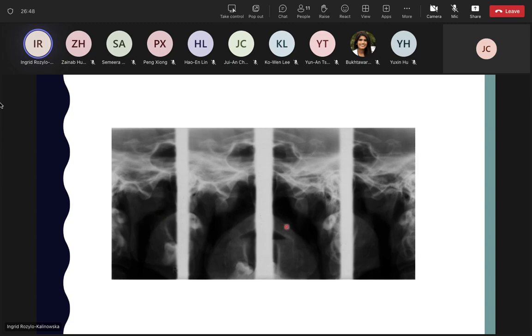So that's the right side, this is the left side, and in fact, such radiographs are a kind of functional radiographs, because they show the difference between maximum mouth closing and maximum mouth opening. And these radiographs are quite useful in everyday practice. So we will have a look at more of them next year when we have lectures in dental radiology.